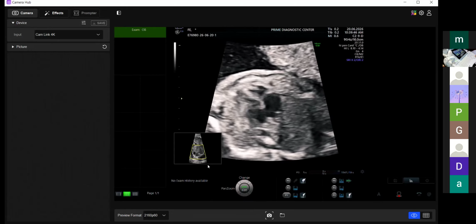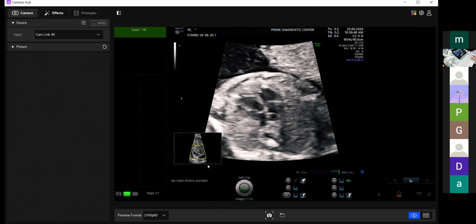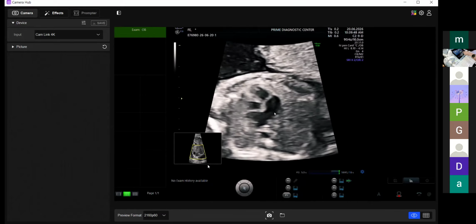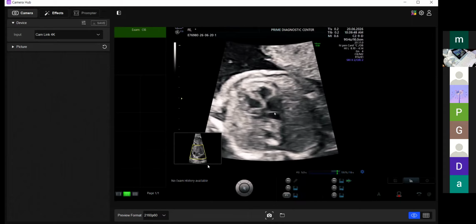And then I look at the four-chamber view and I see something here. And you guys, there have been some issues that many people would call this structure some partition in the right atrium. This is actually eustachian valve. So this is actually eustachian valve. I'll run the cine again. Okay. So see, this is a eustachian valve. Okay. So that is for this.